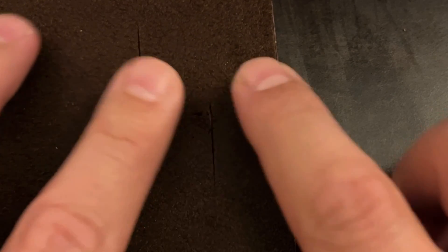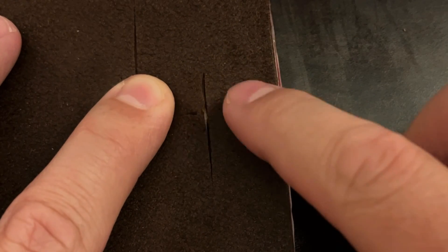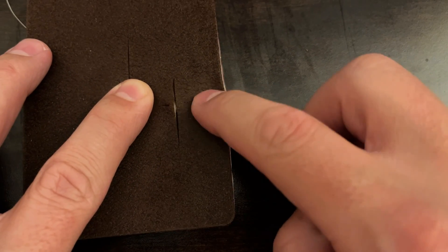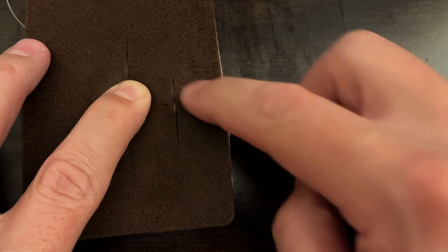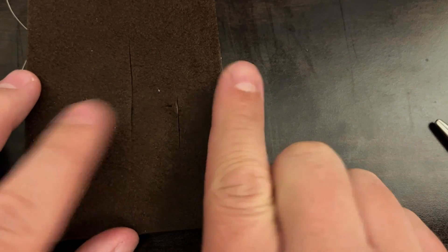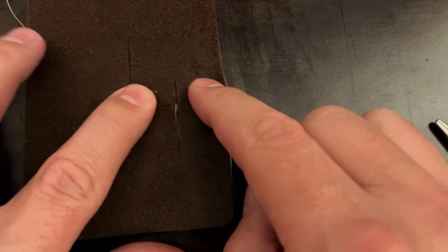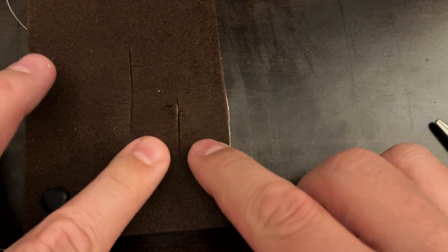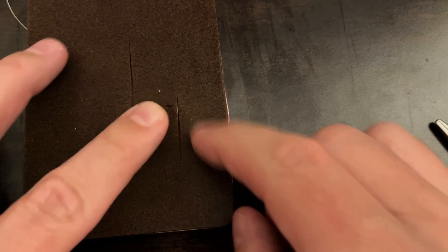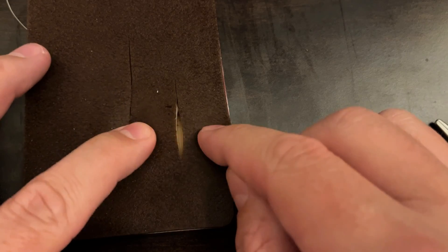That is one interrupted suture, and I would do another one above and maybe two or three below to finish this off, then steri-strips over the top. I'd probably put about five sutures in this length of incision before placing steri-strips over the top. Let me do one more so you can see it again.